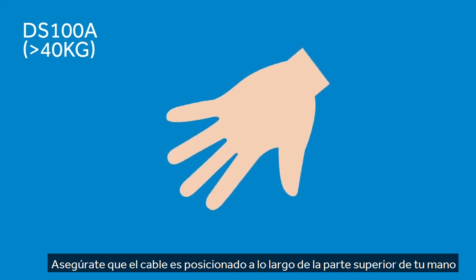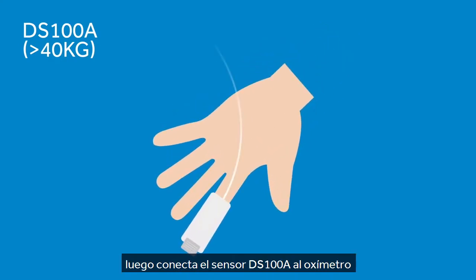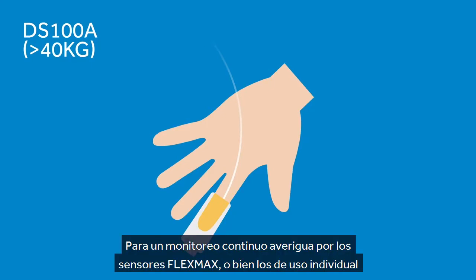Ensure that the cable is positioned along the top of the hand. Then plug the DS100A into the oximeter. This sensor should be resited up to every 4 hours, as it is not built for continuous monitoring. For continuous monitoring, please refer to the FlexMax or single patient use sensors.